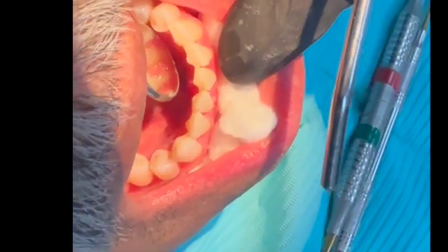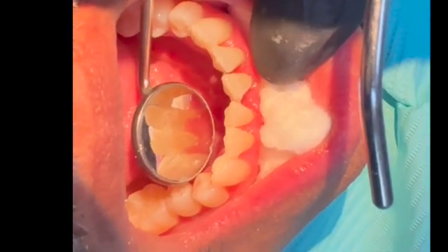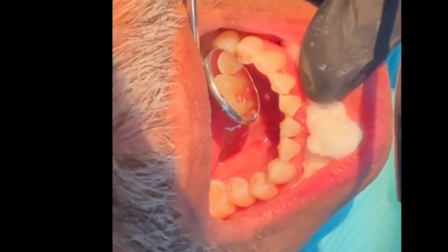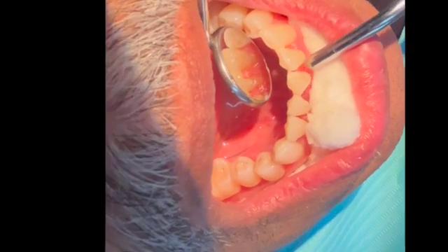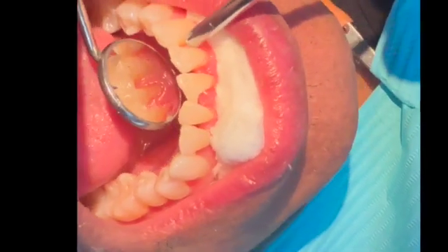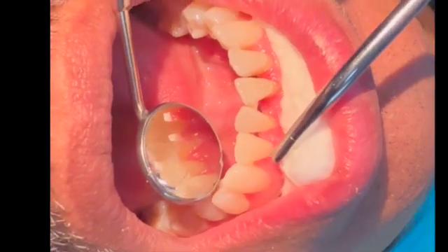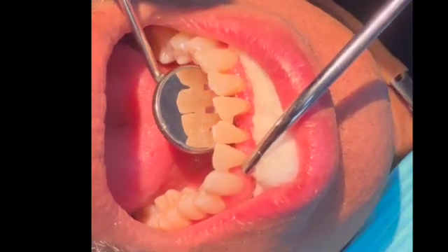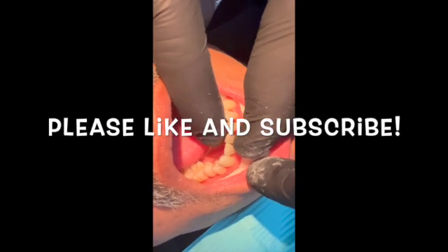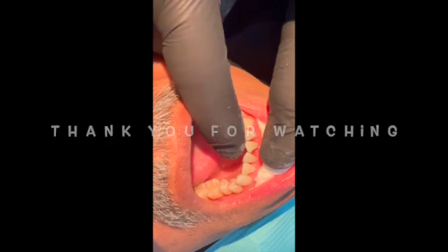We've finished the splint. I haven't polished it yet, but we're going to have him test it with his tongue to make sure it's nice and smooth. You don't have to polish it if you got it smooth to begin with, but you can use your normal composite polishing procedures to finish it out. You also need to educate your patient on using a floss threader to get underneath. With this much space, floss picks might be a better option along with regular flossing — a combination of the two to keep it clean. As far as strength, I can't move these teeth at all — they're nice and firm — so when he's biting into a sandwich or tearing off some ribs, he doesn't have to worry about pulling a tooth out.